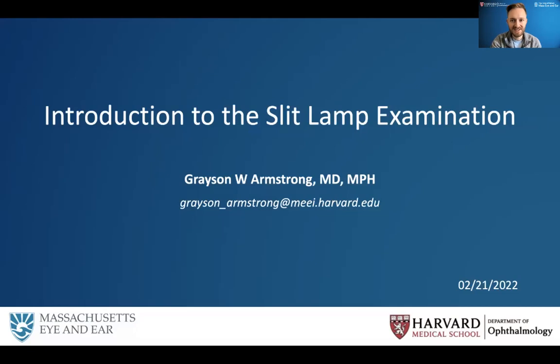So that concludes this lecture. I hope this was helpful, and I look forward to having you practice on slit lamps as a medical student, and certainly as a resident and beyond. It's an amazing skill, and even if you don't end up going into ophthalmology, it's useful for people in other specialties such as emergency medicine, internal medicine, and beyond.